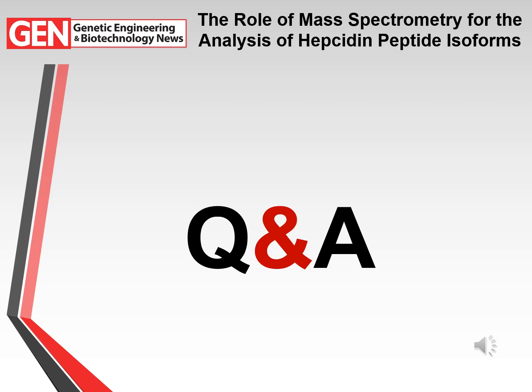So again, this relates to storage. If we know we're going to have to run samples multiple times, it's very important that we aliquot everything out at the beginning to minimise the number of freeze-thaw cycles, so that every sample is reanalysed as required with only one or two freeze-thaw steps, preferably just one.